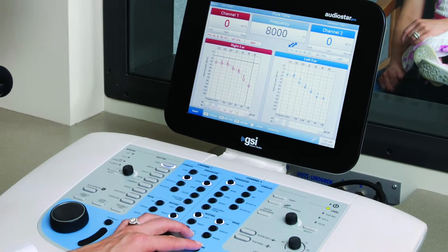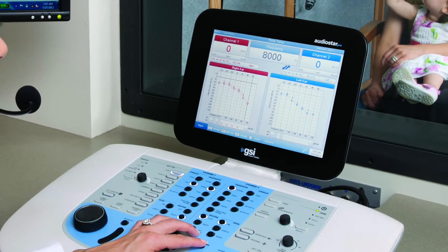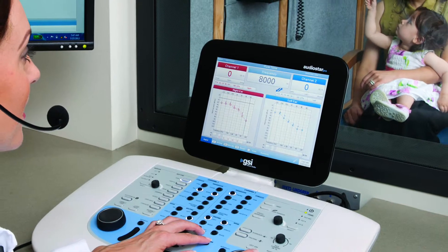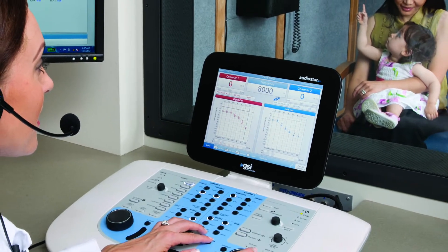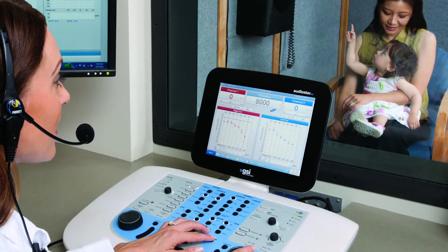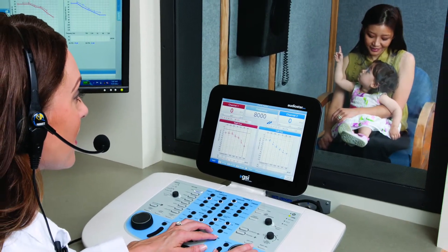Pediatric audiometric testing requires the ability to move quickly between a variety of test stimuli. The AudioStar Pro has added pediatric noise to its list of available test signals. This is a new signal that offers frequency specificity lacking with narrowband noise.